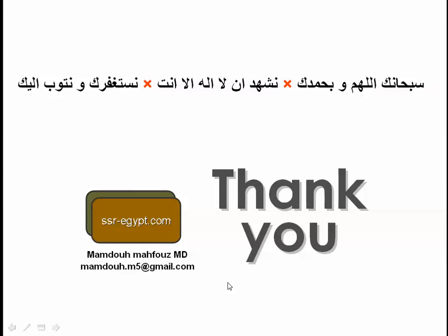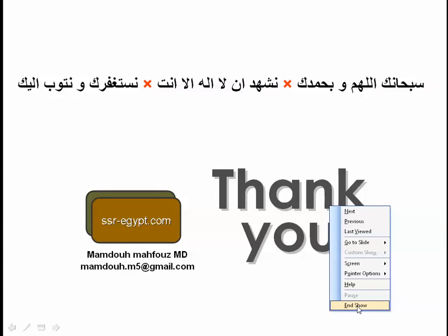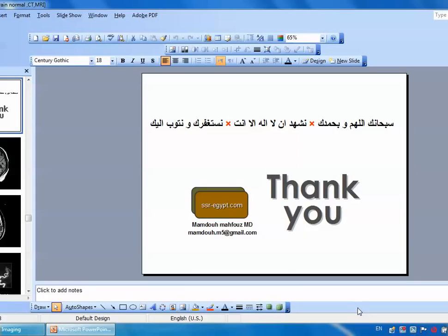And by this we can finish the normal anatomy of the brain by CT and by MRI. Also, we presented some knowledge about the venous anatomy and the arterial anatomy, and I thank you very much.